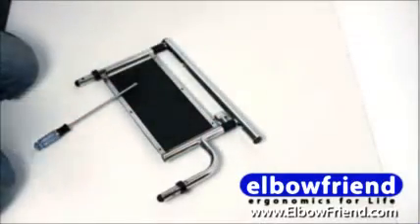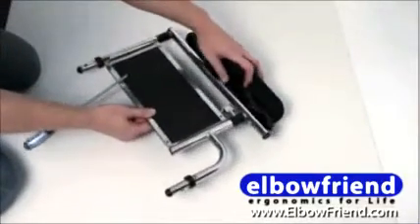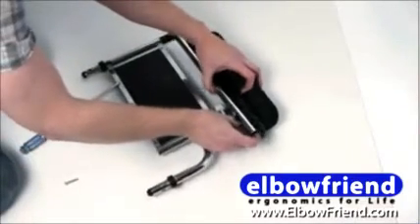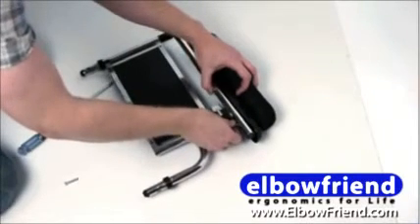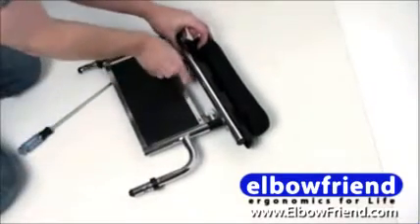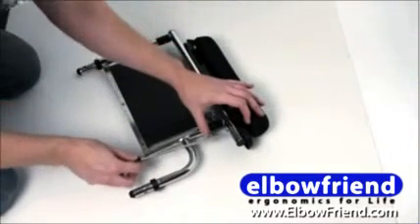Take your old armrest cushion off, put your wheelchair fan in the same place, use the bolts that are provided, and then tighten it up.